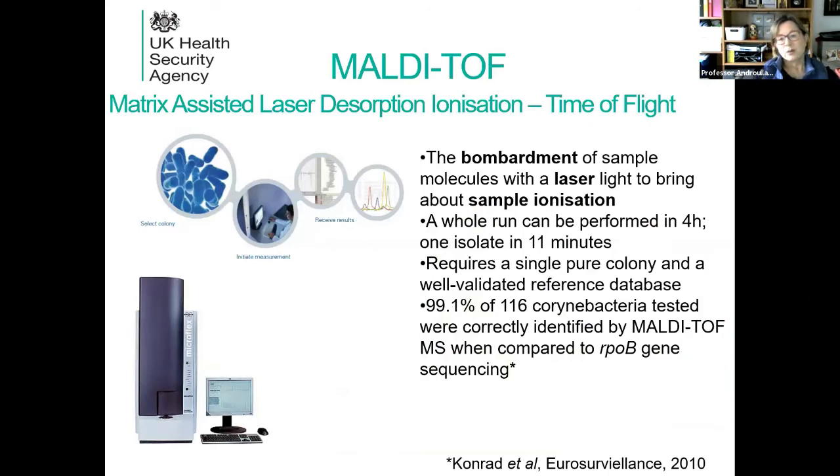And of course, many labs, certainly in the UK and also Europe and the US, now are using MALDI-TOF for identification of pathogens. This is a very useful and very accurate technology. Basically, you're bombarding your sample molecules with a laser light to bring about sample ionization. And the whole run can be performed in 4 hours, usually one isolate in 11 minutes.